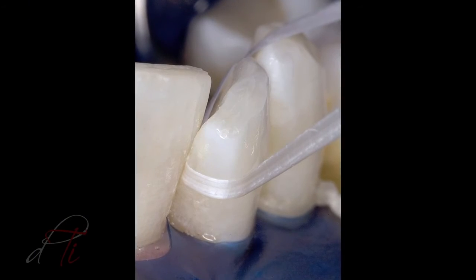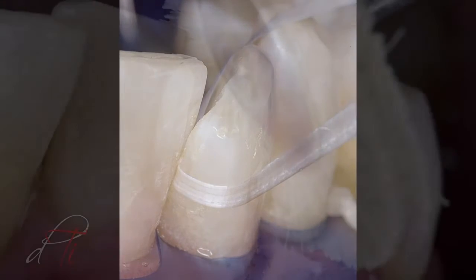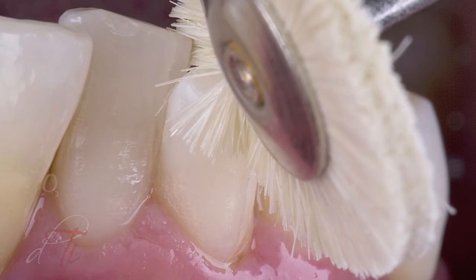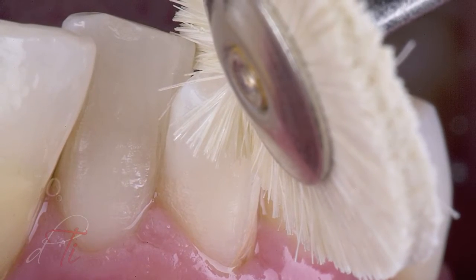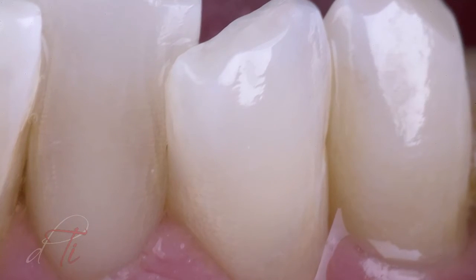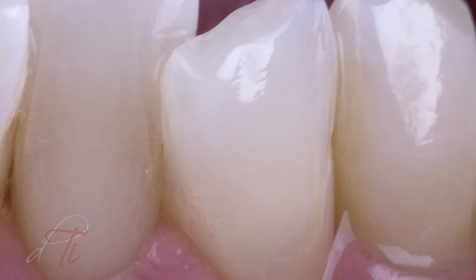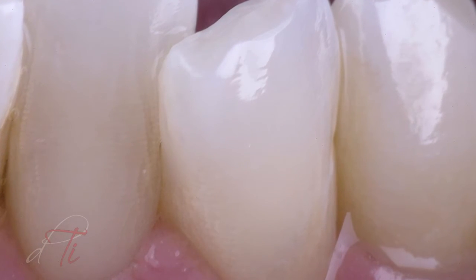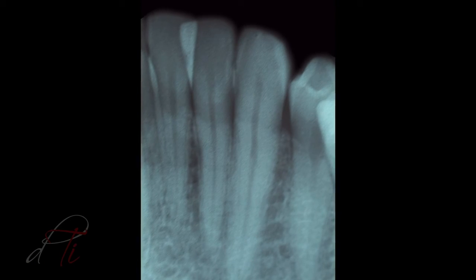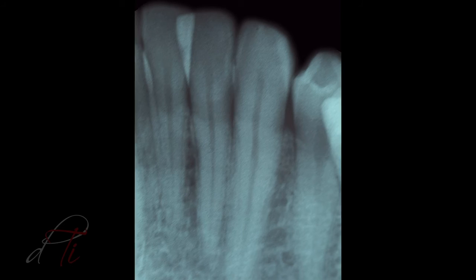The proximal surface was inspected for adequate contact with unwaxed floss prior to removing the dental dam. After the dental dam was removed, a definitive luster and surface reflectivity was accomplished with a goat hair wheel and diamond polishing paste using an intermittent staccato motion. The following restorative procedure demonstrates the optimal aesthetic results that can be achieved in the interproximal zone through proper adhesive protocol and a simplified application of flowable composite resin. Also notice the radiopacity of Genial Universal Flow is similar to enamel, which makes it easy to evaluate the interface and to identify recurrent caries.